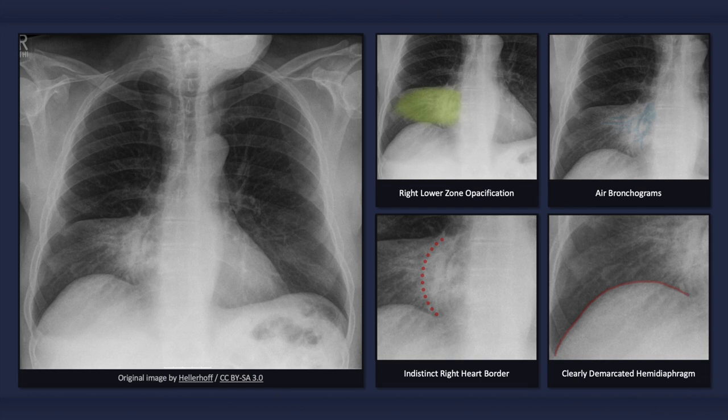To quickly recap, on an x-ray depicting right middle lobe pneumonia, we would expect to see right lower zone opacification with air bronchograms and an indistinct right heart border, but with a clearly demarcated right hemidiaphragm.